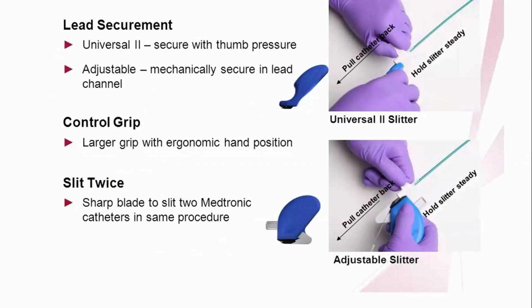And then the final step is removing your equipment, and basically you want to remove your splittable guide. There are different kinds of splitters available, and the concept is that the splitter will fix the lead in place as you pull out the catheter.